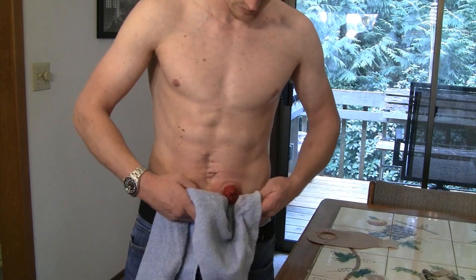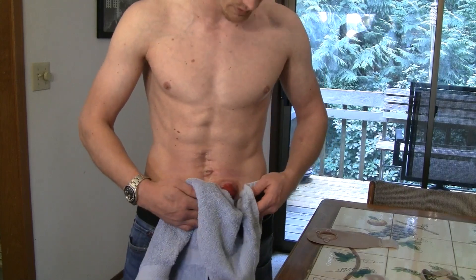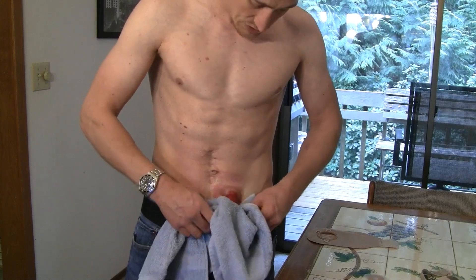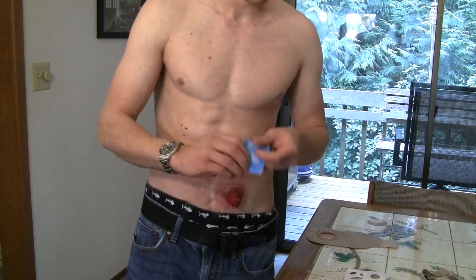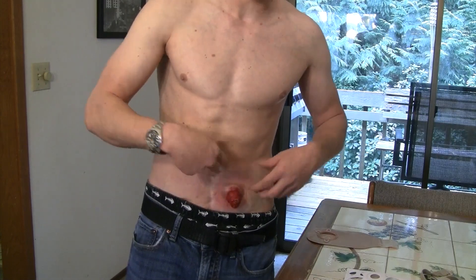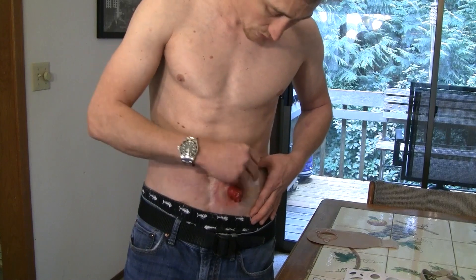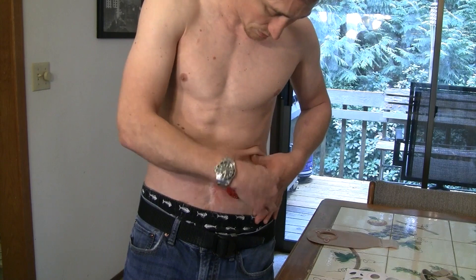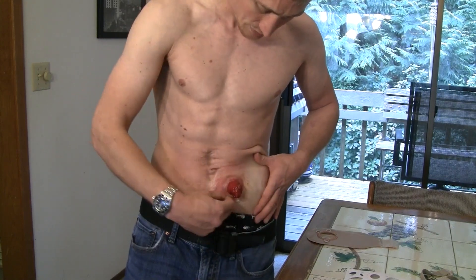I prefer paper towels or an actual towel over toilet paper. I do this in the bathroom where toilet paper is readily available, but I find toilet paper tends to cling to my stoma, and even more so when I put my skin barrier on — it clings badly, is hard to get off, and you have to re-clean. So toilet paper doesn't really work well for me.